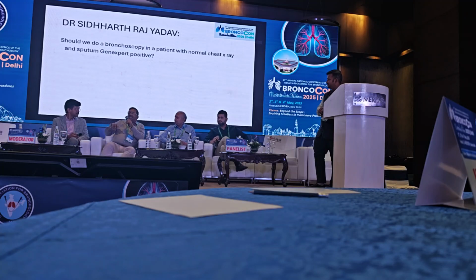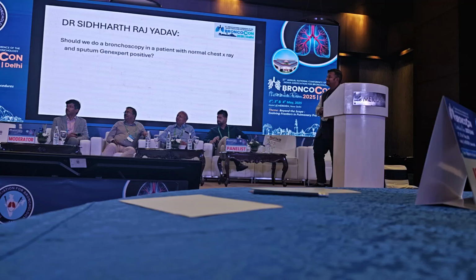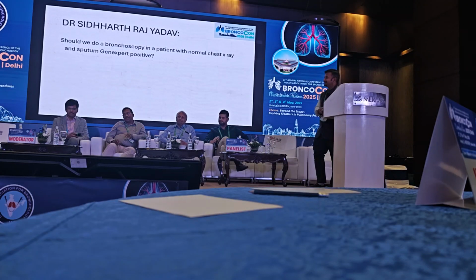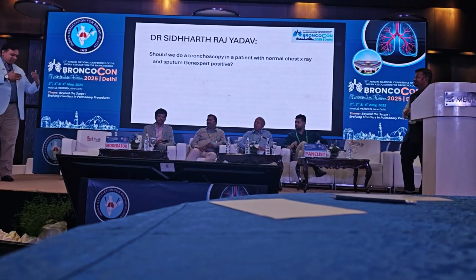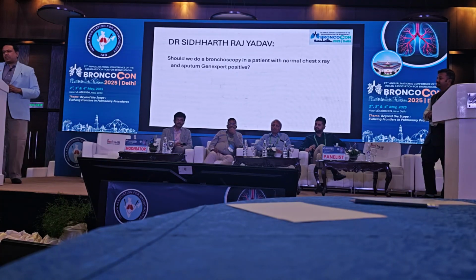One thing I want to add in this context. Suppose clinically we are suspecting some local lesion, that means clinically we suspect some form of endobronchial growth might be there, which could be the cause of the sputum positivity. One googly was inside, but we had not mentioned the CT scan. So you can ask for a CT scan first, and then decide. So basically, X-ray, CT scan, and then bronchoscopy. That will help us in telling the clinical picture over here.